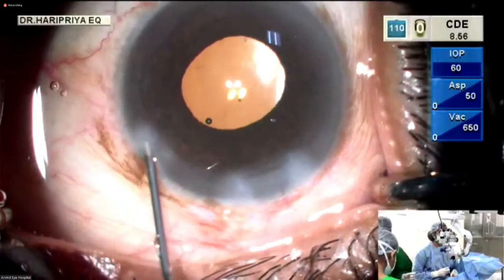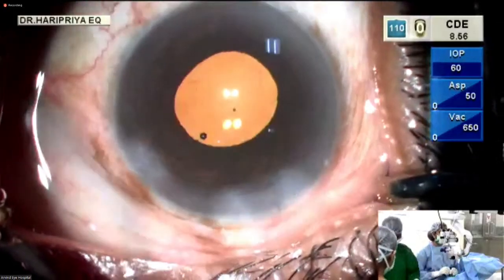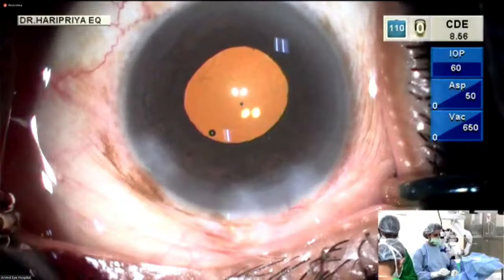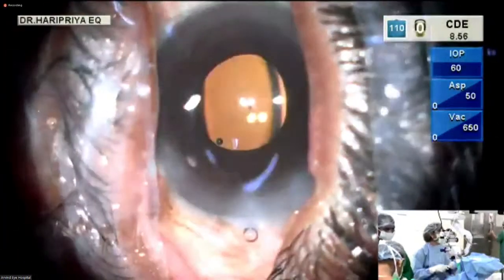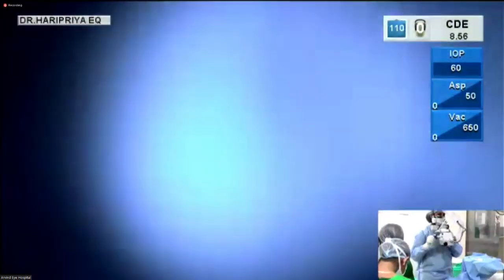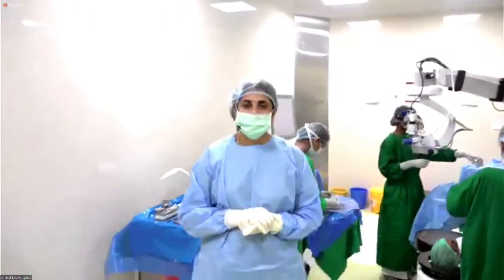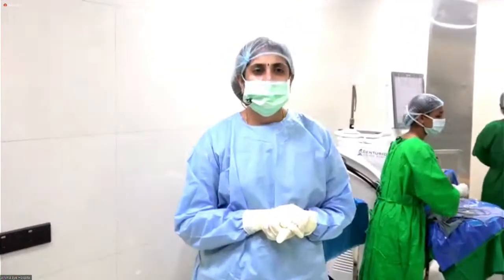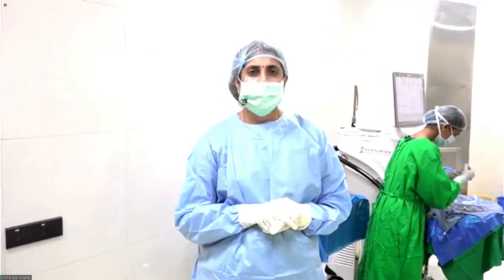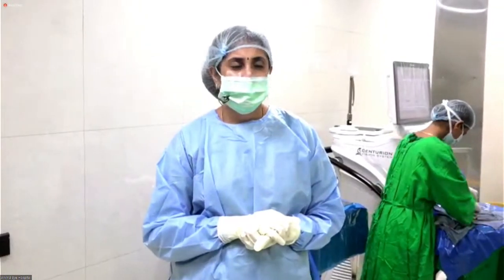And also, we have had a good experience in patients post refractive surgery. We have been placing these IOLs, and they have been very happy with the quality of vision too. And as you said, you keep a target refraction of minus 0.3. Yes. So I guess because of that, the patients will have good distance vision as well. It may be 6/6 partial, but it will be very good, and a reasonably good near vision. So when you implant the lens in both eyes with that kind of target refraction, the patient will have bilaterally 6/6 and close to N6, maybe.